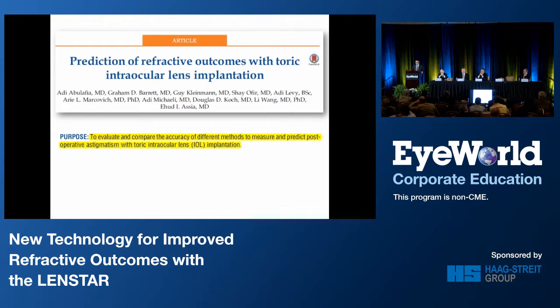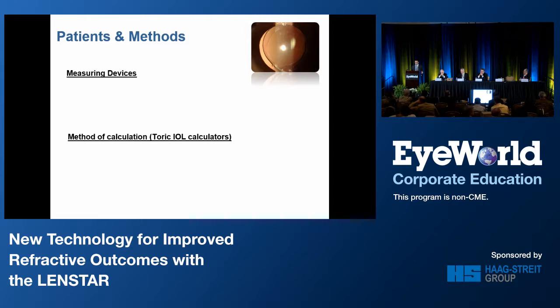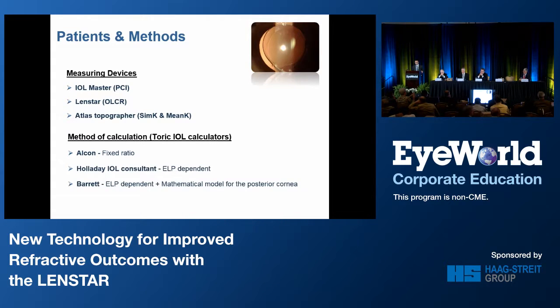This is one of our recent studies, in which we evaluated the prediction of refractive outcomes with toric IOL implantation using different devices and different methods of calculation, including the Barrett Toric calculator. This was a retrospective study that included 68 eyes of patients who underwent uneventful cataract extraction with toric IOL implantation. For the measuring devices, we used the IOLMaster, the LENSTAR, and the Atlas topographer. For the methods of calculation, we used the Alcon Toric calculator, which uses a fixed ratio to estimate the cylinder power of a toric IOL at the corneal plane, and the Holladay and Barrett Toric calculators, which use the effective lens position for the same purpose.